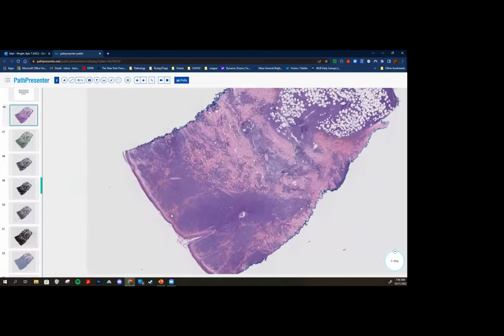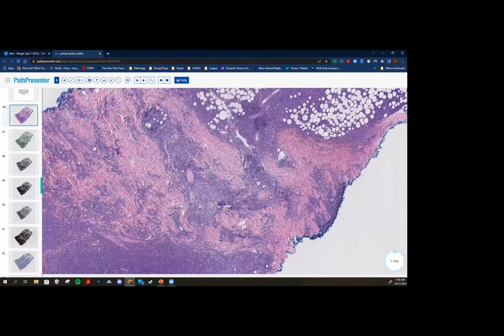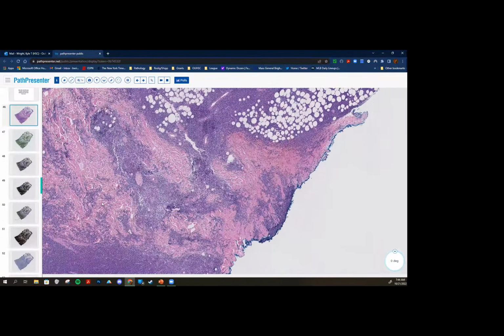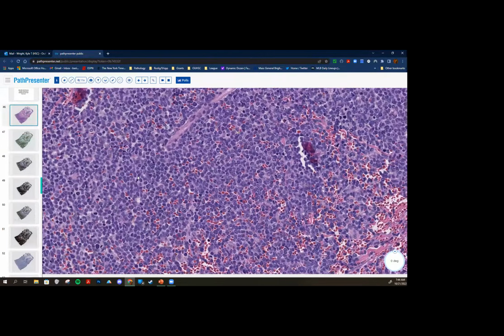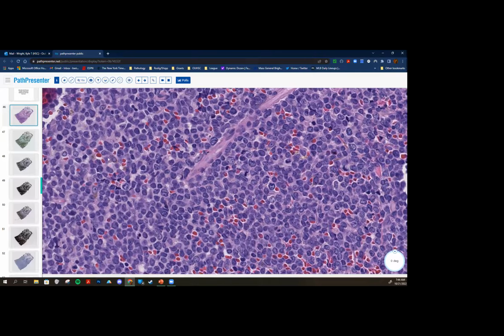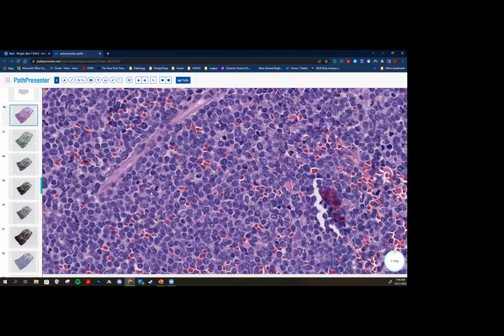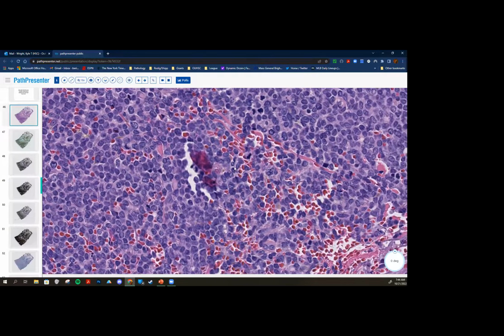And you can see it's very similar to the last lesion. You have the superficial dermal perivascular infiltrate. I guess you're probably getting tired of me saying that by case number 6, but that's the description. This is diving deep all the way down into the subcutis. The epidermis is still fairly uninvolved, and you have a sheet-like infiltrate of these cells with a fairly blast-like morphology, except they may have a bit more of this pinkish cytoplasm than the blasts of the last case. And also, what else do you see here?